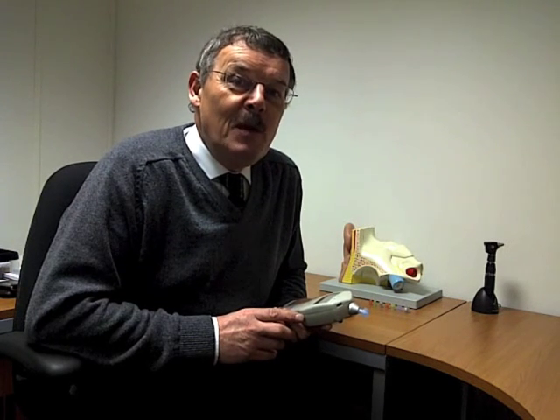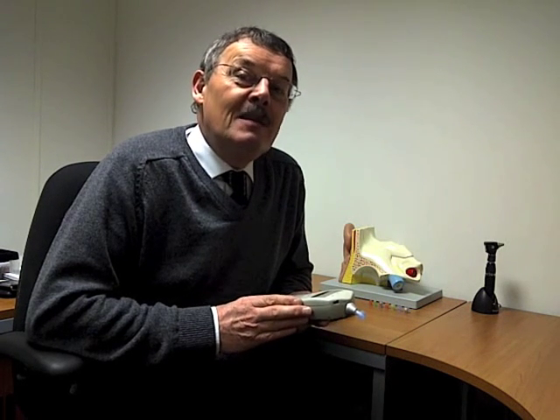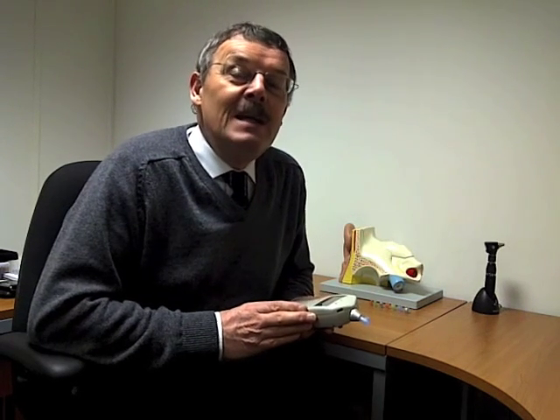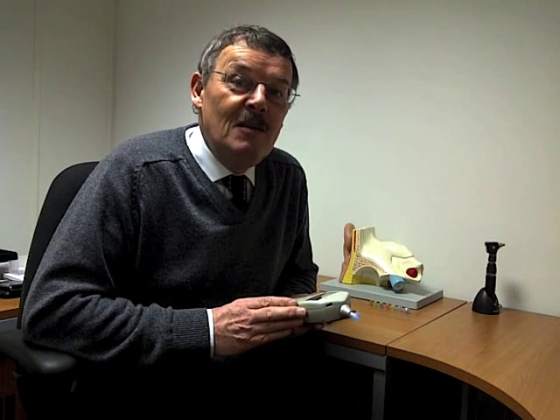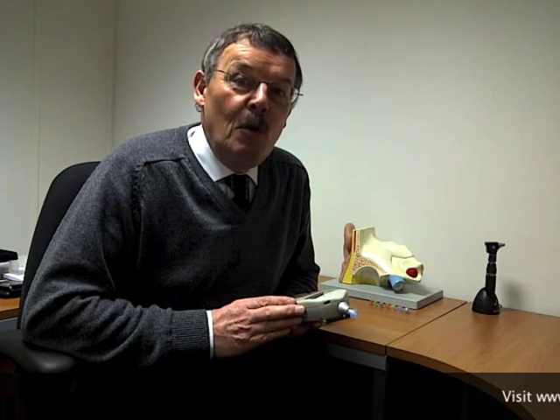Sometimes we'd like to do a little bit more with you, and that would involve other tests, and one example is the test we're going to talk about now, and that's tympanometry. And why we do that is sometimes we're not sure whether or not there is a problem with the conductive part of the ear. That's the part of your ear that has the sound waves going through from the outside, through your ear canal, sets your eardrum into vibration, and then those vibrations are passed on into the inner ear by the ossicular chain, the three tiniest bones of your body, the malleus, the incus and the stapes. And the test that we use is called tympanometry.